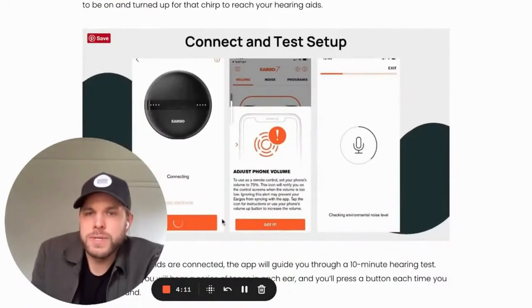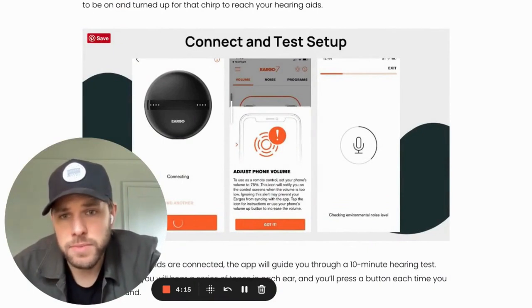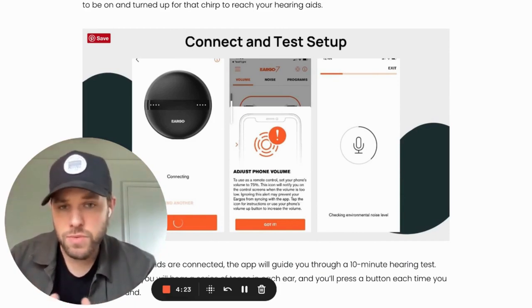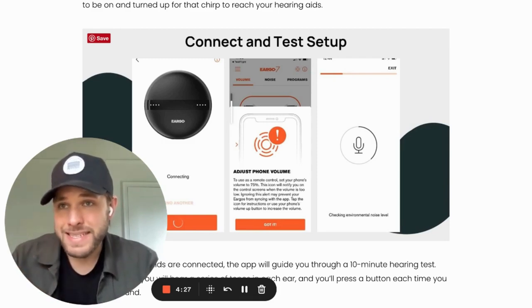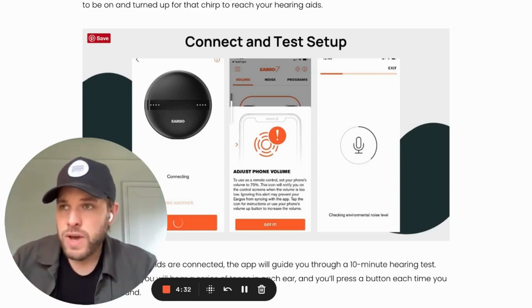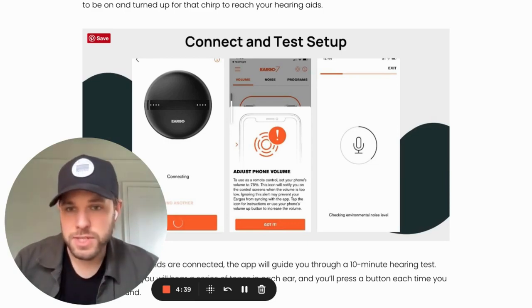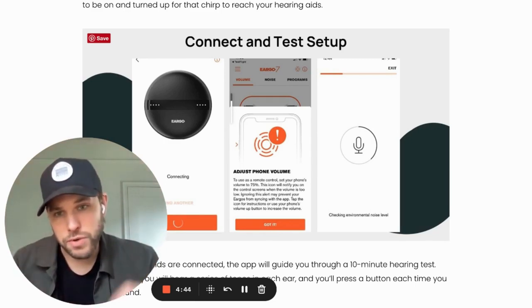Let's talk about app controls. If you get a pair of hearing aids from Eargo, you'll charge them up and then connect them to the Eargo app — I found this process was pretty easy. One thing to note is the app uses high-frequency sounds to communicate with the hearing aids while they're in your ears; it doesn't use Bluetooth. So you have to have your phone volume turned up to about 75%. The app will instruct you to do this, but your phone needs to be at a decent volume in order to talk to your hearing aids.